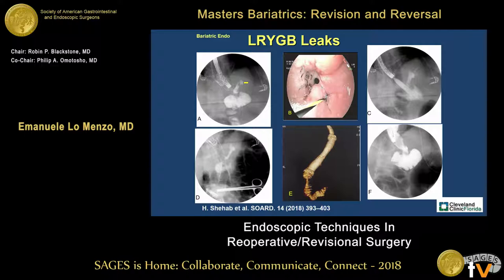This is how stents are placed: an initial evaluation endoscopically with contrast under fluoroscopy. We identify the area of the leak and then pass a guide wire distal to that, because most of the time we have to dilate the sleeve and relieve the distal obstruction. You can see the actual waist of the stent compressed in the stricture, a nice 3D reconstruction of the CAT scan, and then a few weeks later, complete resolution of the leak.